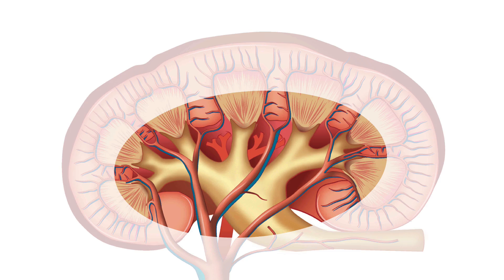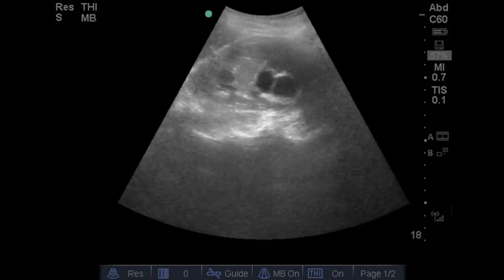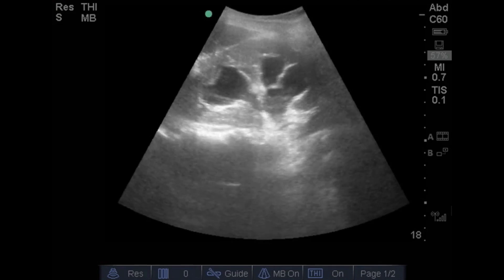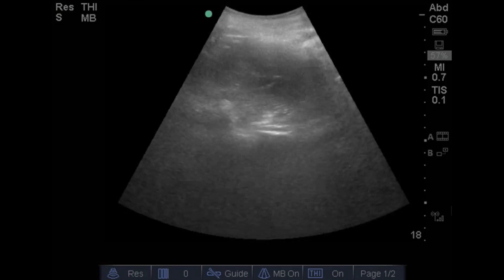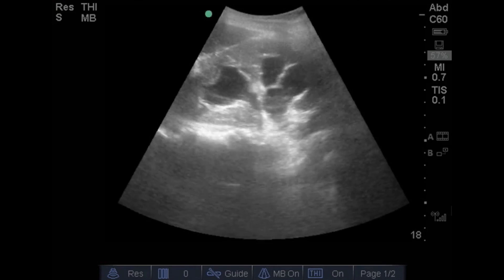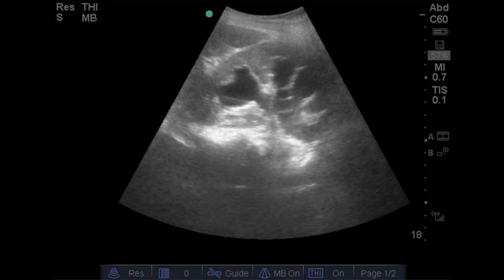Moderate hydronephrosis means dilation of the renal pelvis with the calyxes starting to dilate — dilation of the collecting system to the level of the pyramid. Here you can see moderate hydronephrosis with dilation of the renal pelvis and calyxes up to the level of the pyramid, not reaching the cortex. The calyxes are separated — this is also known as the bear claw or hen formation. The calyxes are dilated but the columns of Bertin are still visible between them, allowing you to differentiate between individual calyxes.